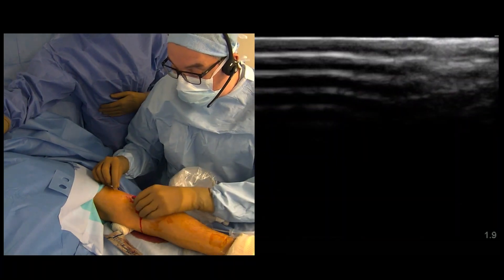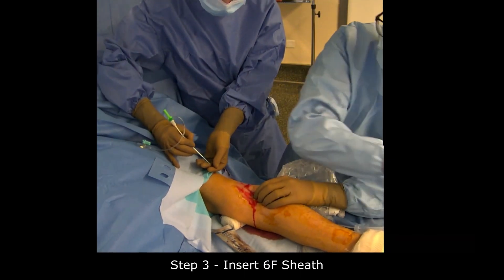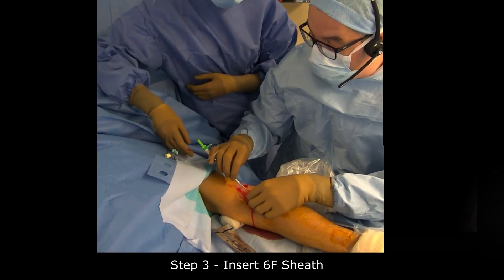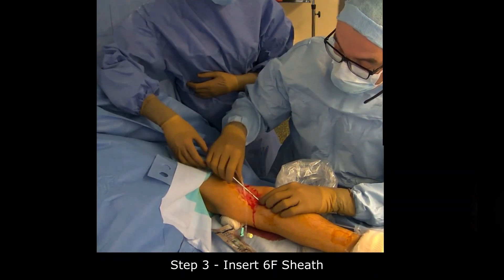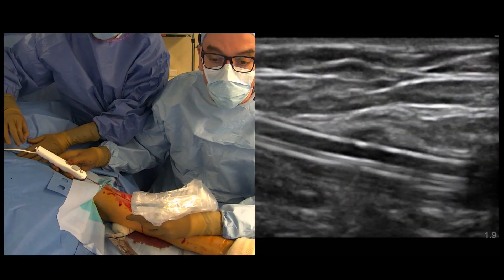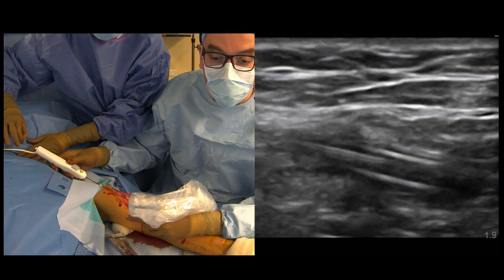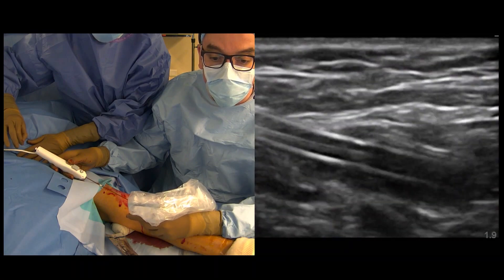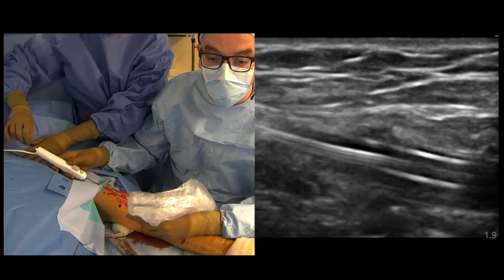We take the needle off and place a 6 French Slender Safe sheath, which is a radial artery sheath with a 6 French internal diameter and 5 French external diameter — excellent. Now we are seeing the sheath at the level where it is entering the artery right there. You can appreciate the artery and the sheath going in at this level.